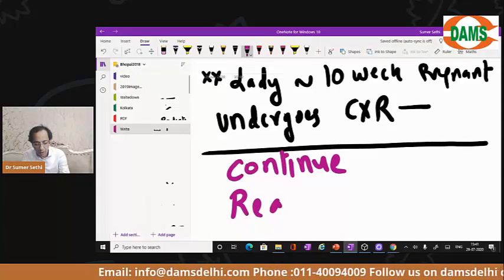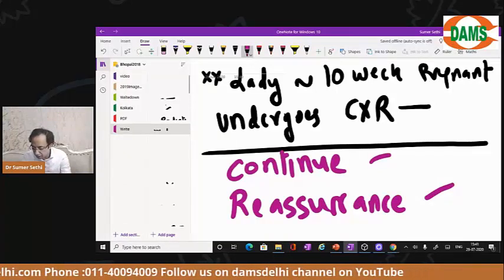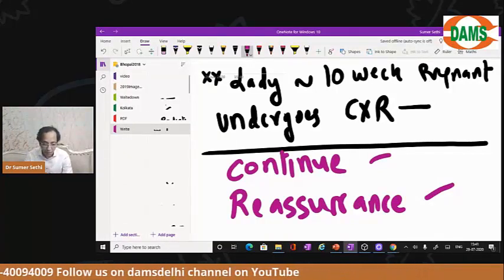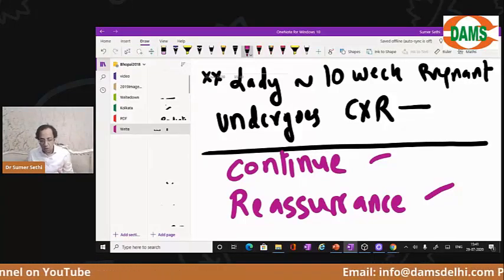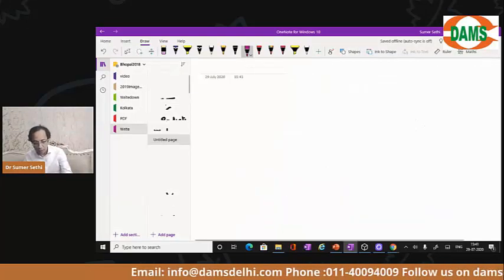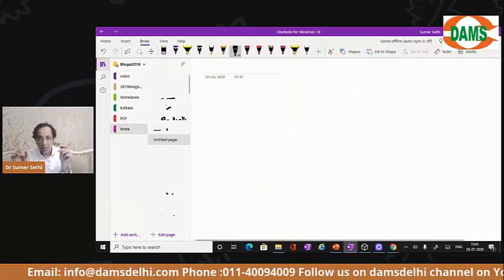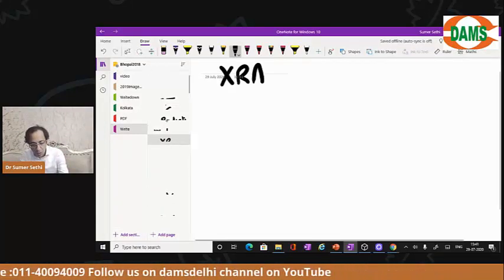So I'm sure now you are able to get a hang of it. This is the pattern of the exam now. This is our previous NEET PG question. And this is now, they're asking common sense things. They're not asking those rote learning things. They're asking common sense things to you. Now, my question number one is, if CT scan is using X-rays, then how is an X-ray different from a CT scan?